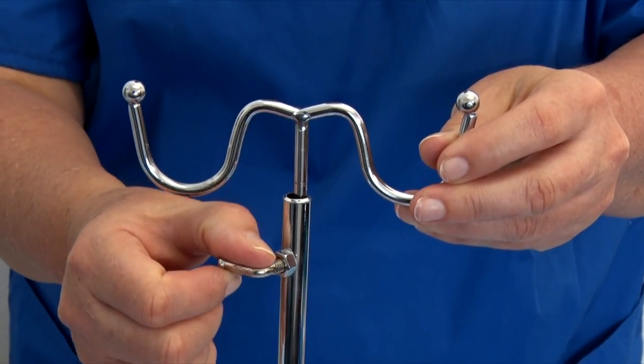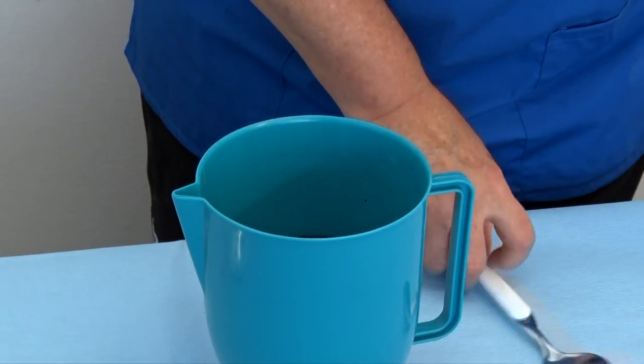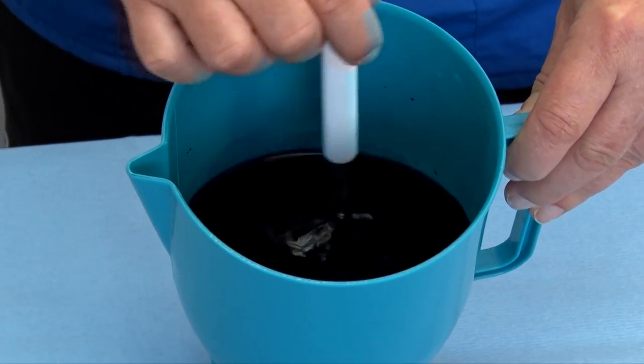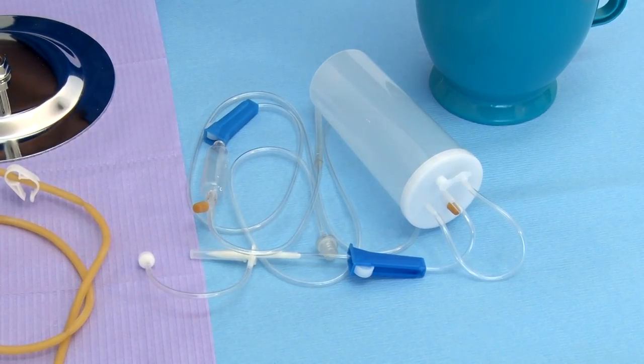Step 5: Secure the extension part of the stand unextended. Step 6: Fill a container with water or saline and red food colorant and stir a bit. Step 7: Proceed with assembling the reservoir container.